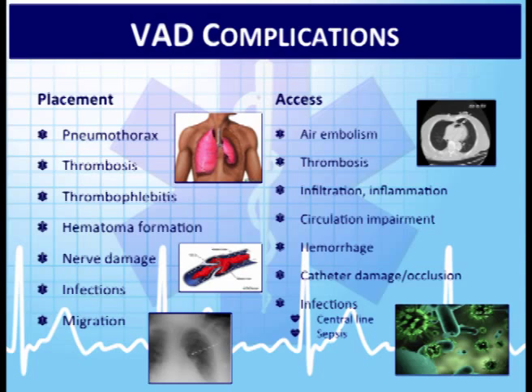Thrombus. It's a tube in the body that's foreign, and the body is not always going to like that, so a thrombus could form either at the end of it, within, or around the tip. Infiltration and inflammation: just like everything else, if that device comes out of central circulation or out of that vein, let's use a subclavian, for instance. If it comes out of the subclavian vein, where are we infusing all the solutions? Into the chest, right? Obviously not a good thing, but by assessing the site, we would hopefully be able to figure that out.